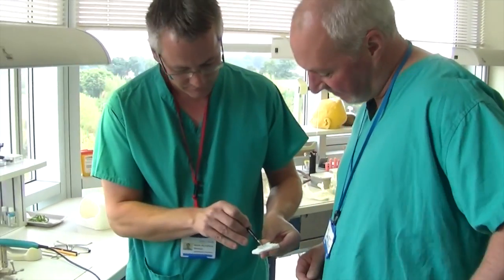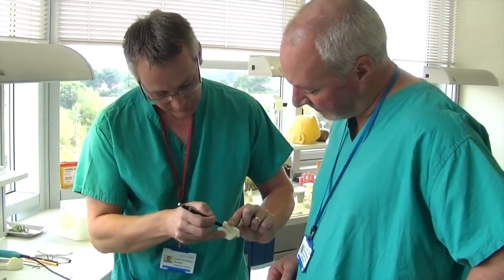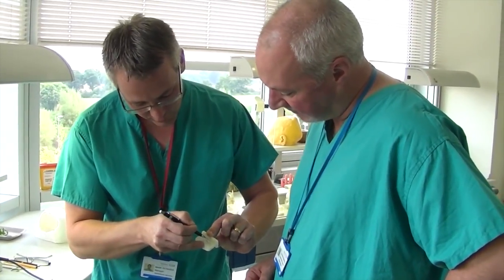3D printing and the way it affects the medical world, it's improving patient care because the surgeon is able to pre-plan that operation to a higher degree. He's got a better understanding. All the staff going into that theatre have a better understanding of what's going to happen. Sometimes conceptually and spatially it's difficult looking on a computer screen to establish the exact dimensions of the bone that's available to you for surgery.